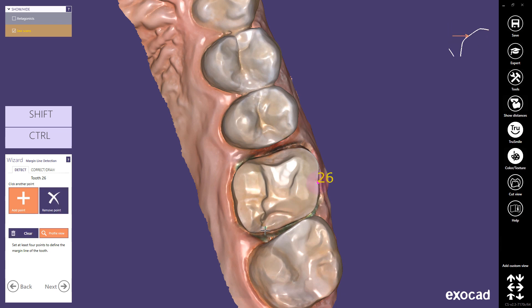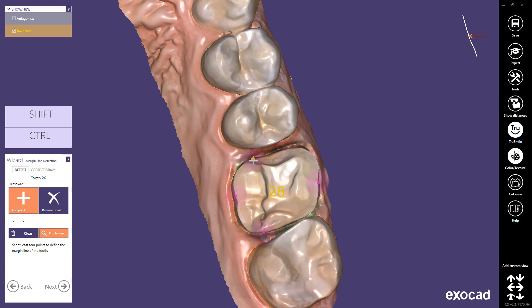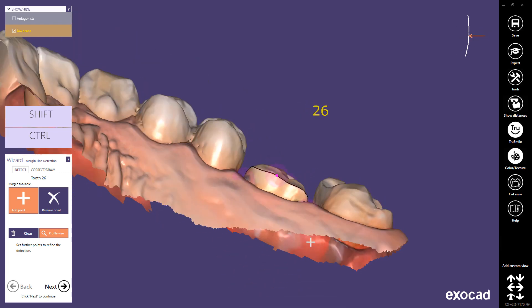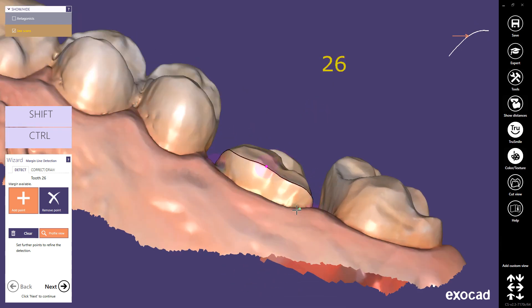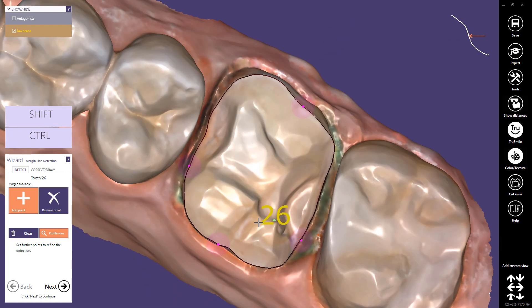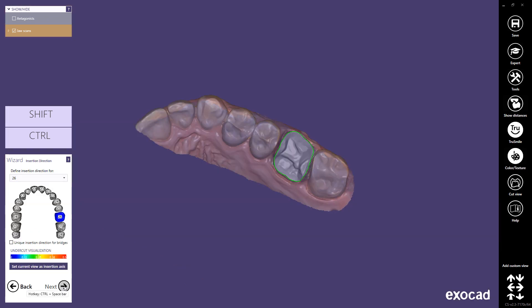Click on the buccal margin line. You can help the algorithms by adding more additional points on the margin line. For onlay margin detection, four points are required. You can use the right mouse button to rotate the view and the mouse wheel to zoom in and zoom out. Click on the Next button to proceed to the next step. The hotkey for the Next button is Ctrl and Spacebar.